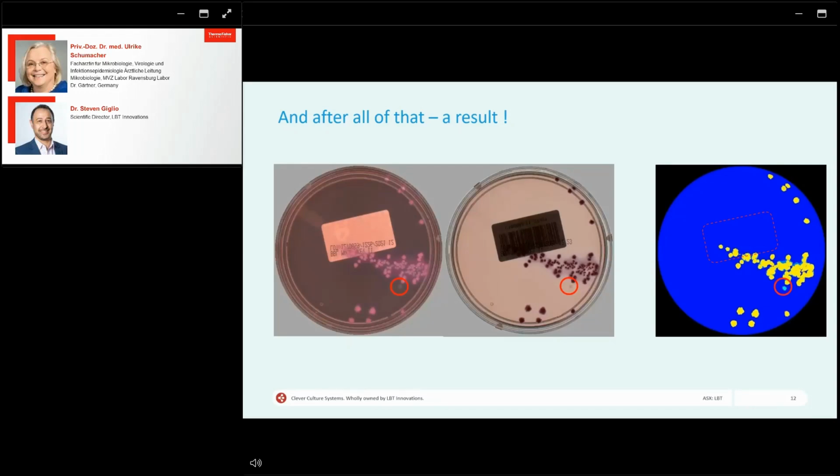And if you look at the 11 o'clock or 10 o'clock position on the McConkey plate as well, there's also the plate location mark that's also been removed. So it's really cool stuff to be able to do that and develop it. So I feel fortunate to be able to do that.